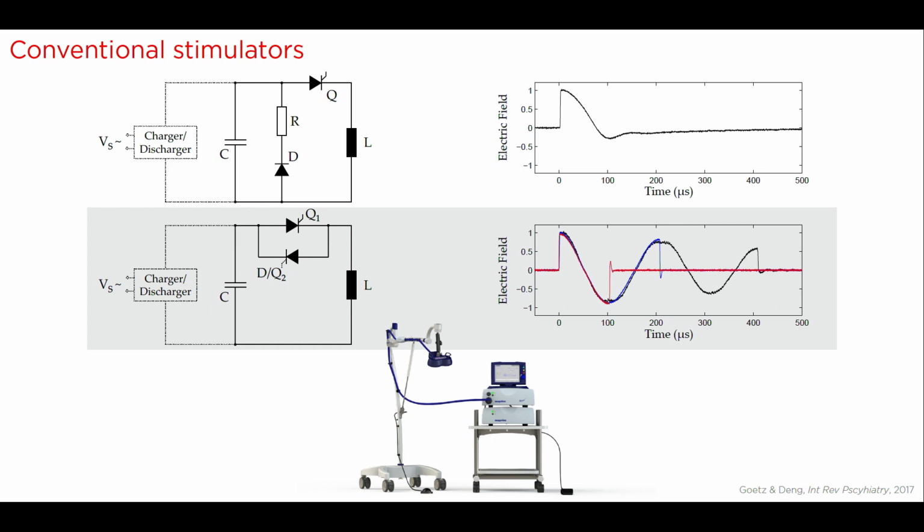Most of the energy is in the first phase of the temporal waveform, so it is monophasic. You can remove that resistor in the middle, and have on the second phase most of the current returning to the capacitor. This generates a biphasic pulse. Basically, you get one complete cycle or multiple cycles of a cosine wave.